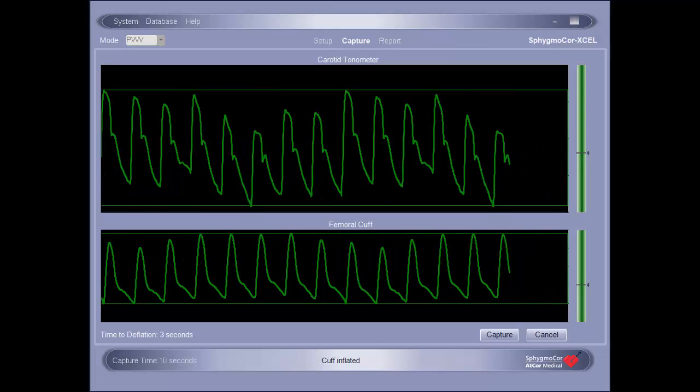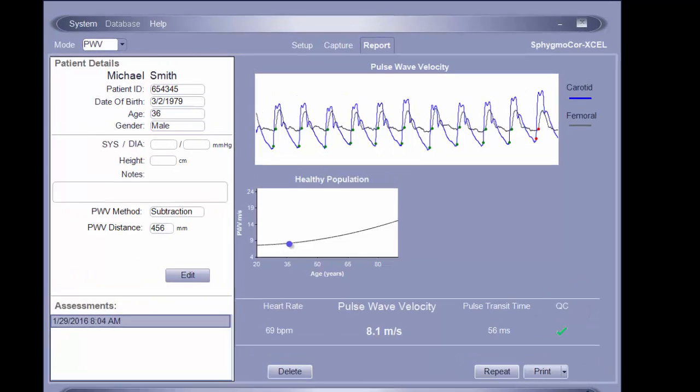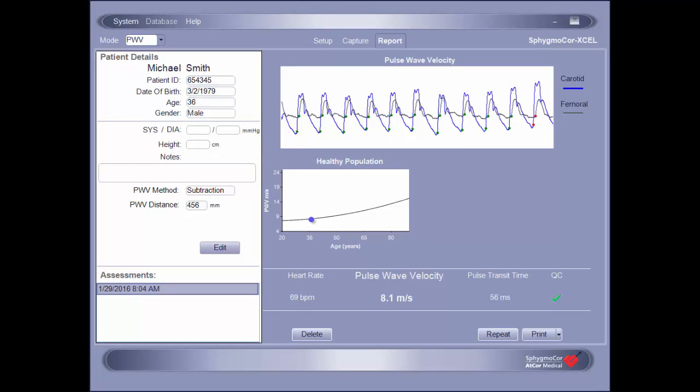Once the assessment is captured, the report will automatically be displayed. It is important to first evaluate the quality control indicator to determine if the report can be considered acceptable. A green check indicates an acceptable assessment, while a red cross indicates that the assessment should be repeated. In addition to the quality control indicator, the waveforms should be viewed to ensure they display a well-defined upstroke. Waveforms that are noisy or lack upstroke definition should be repeated. To repeat an assessment, simply click the Repeat button in the lower right-hand corner of the report screen.